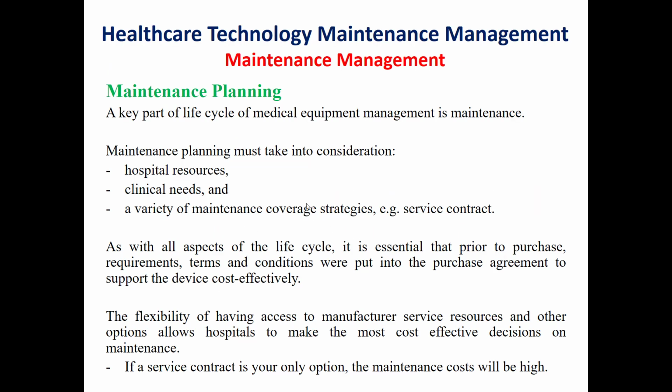In the general talk about the maintenance management, we'll talk about the maintenance planning, the elements and the activities in the maintenance management. Now we'll start with the talk about the maintenance planning. Maintenance is considered as a key part of the life cycle of the medical equipment management. Maintenance planning must take into consideration hospital resources, clinical needs, and a variety of maintenance cover strategies.